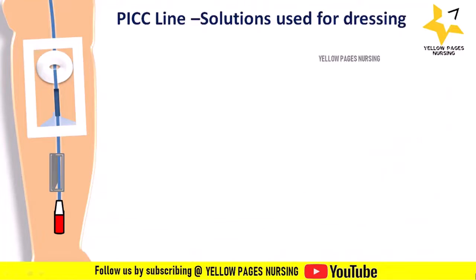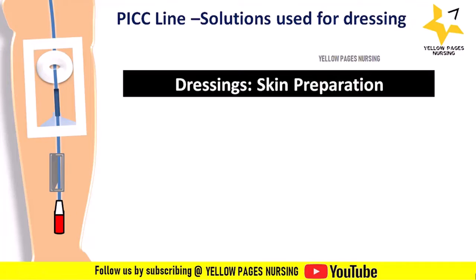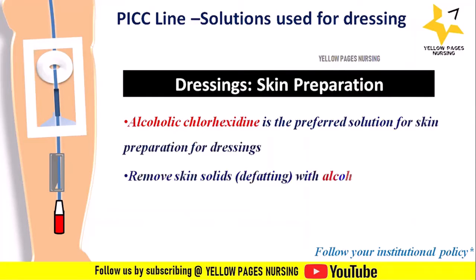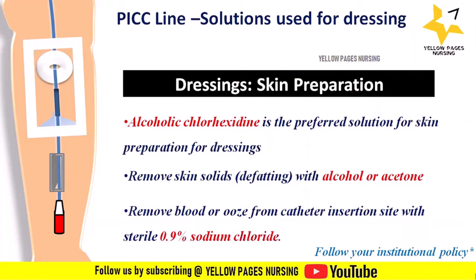Next are solutions used for skin preparation while dressing. Alcoholic chlorhexidine is the preferred solution for skin preparation while dressing. Remove skin solids, defatting with alcohol or acetone. Remove blood or ooze from the catheter insertion site with sterile 0.9% sodium chloride.